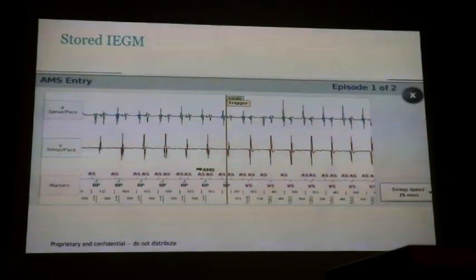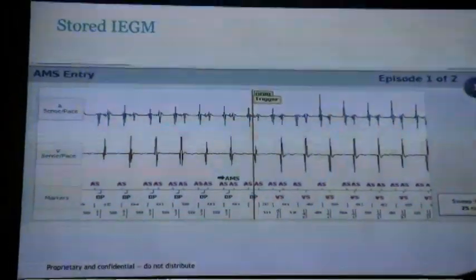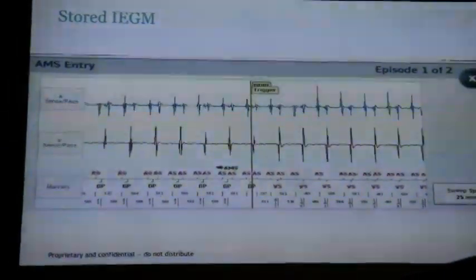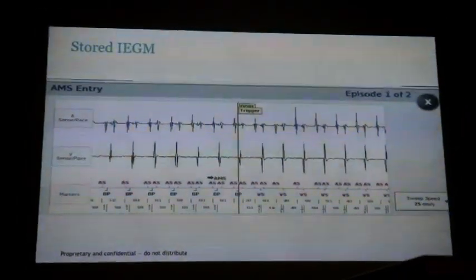So if I was working the PSA, when the physician puts the atrial lead in, I'm not just looking at the size of the P wave. I'm looking at its morphological characteristics, and also if there's an R wave coming through, a big R wave. When you test during implantation, you test for sensed R wave. Sometimes you test for paced R wave, in the configuration of the spike. So I would definitely be looking at the P wave amplitude at implant, but if there is a far field, you want to look at that in both A sense, V sense, and A sense, V pace, because it can change.